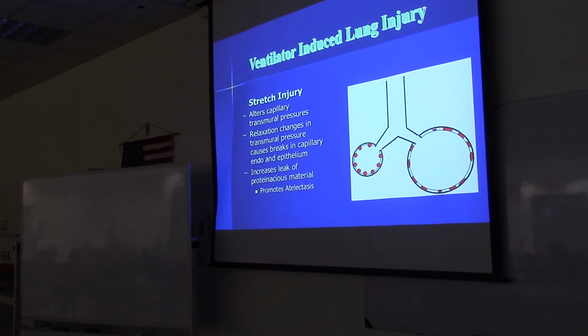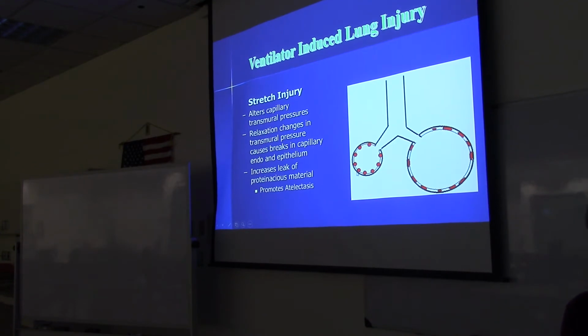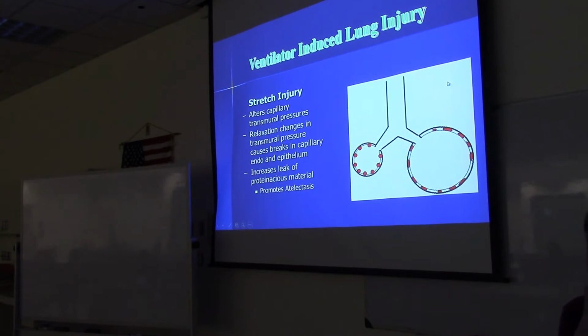When we place a patient on the ventilator, the positive pressure causes some problems. It causes alveoli that have normal compliance to get more of the tidal volume, and alveoli that are stiff will get less of the tidal volume. So even if our airway pressures are normal, we're getting volume-induced lung injury by overstretching the good alveoli. That's called volutrauma, where you overstretch the good alveoli.